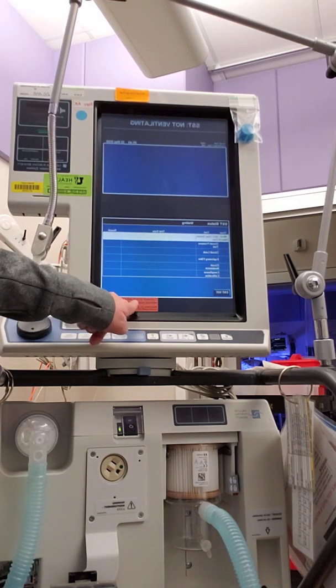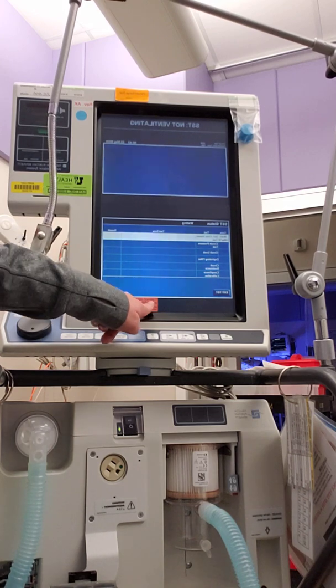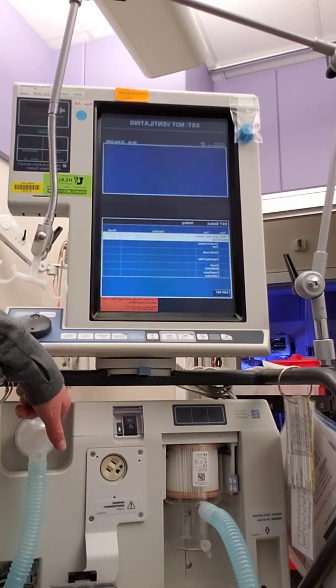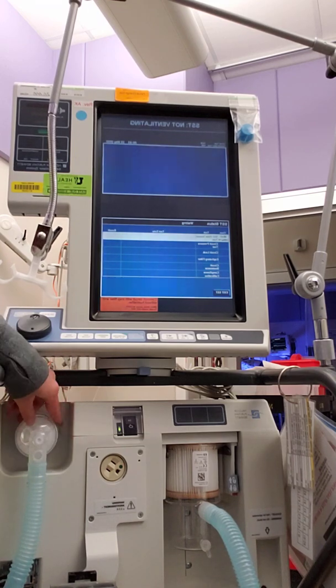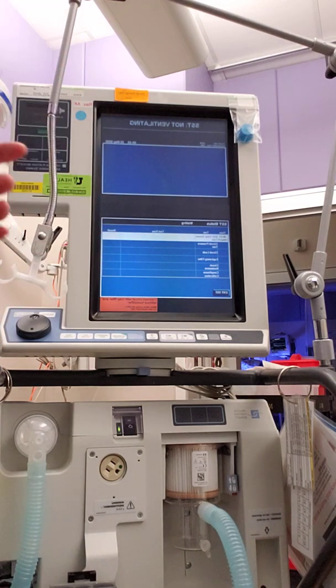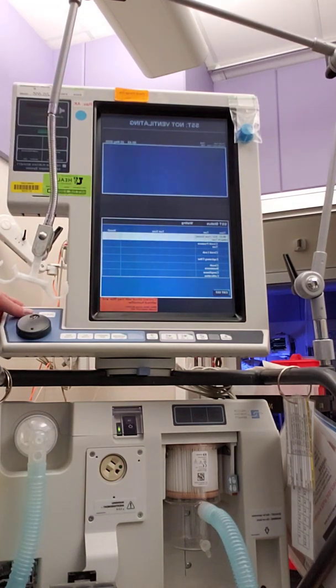This one says connect circuit with inspiratory filter and without humidifier. We've done that, and then you press accept when it's done. So we've connected it with an inspiratory filter right here, and we don't have our humidifier because we set up for an HME. Now we're going to press accept.